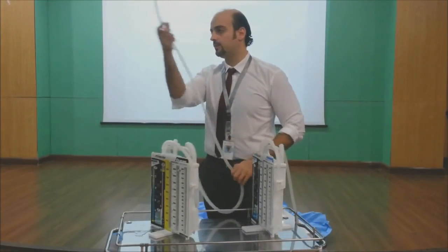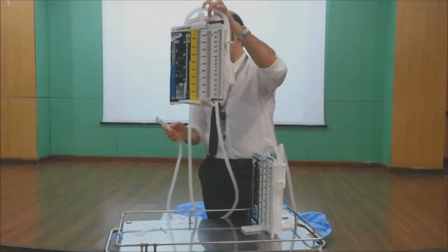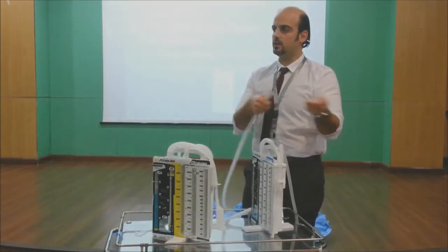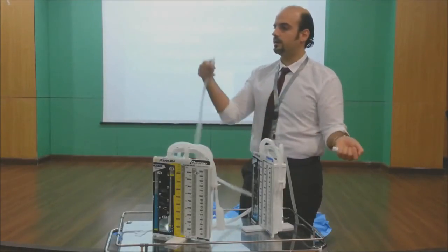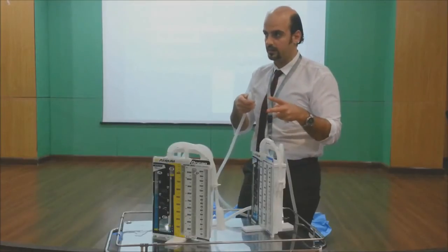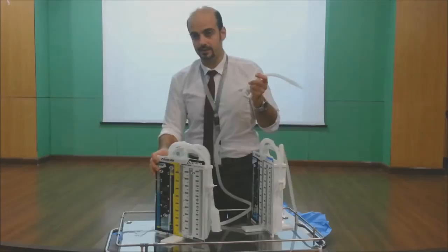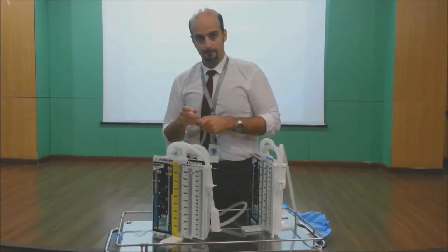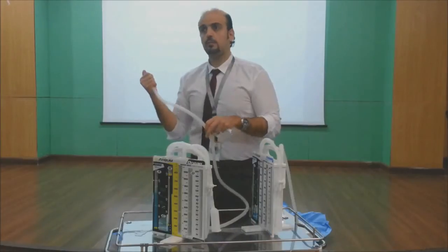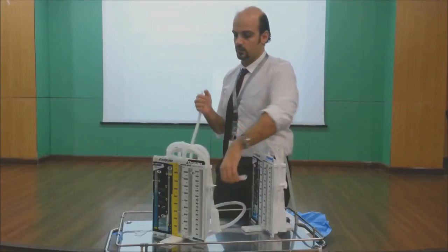Then chest tube of the patient. My system is ready, all the chambers are ready. Chest tube is clamped. Disconnect the old one and connect the new one. Declamp, don't forget to declamp it again, because a lot of us forget to declamp it. And test. What to test? Before negative suction, what to test? Is it working or not?